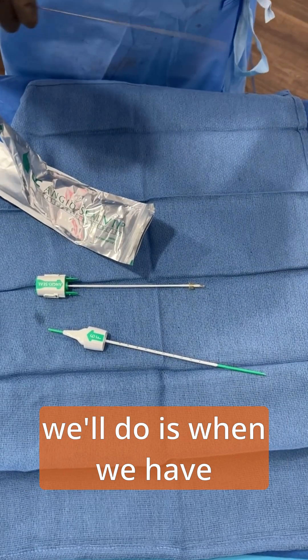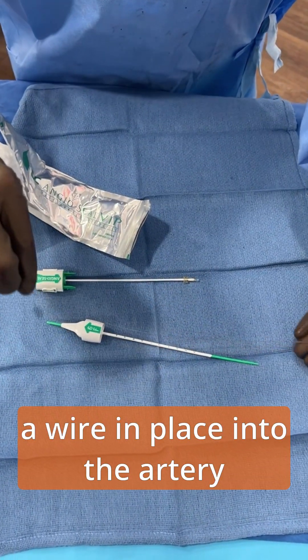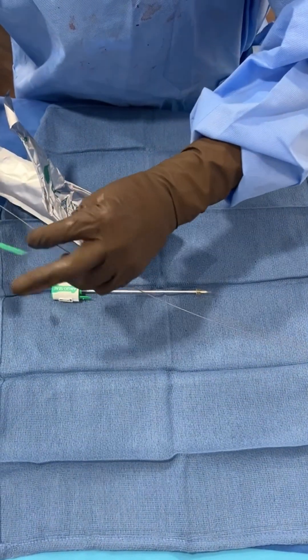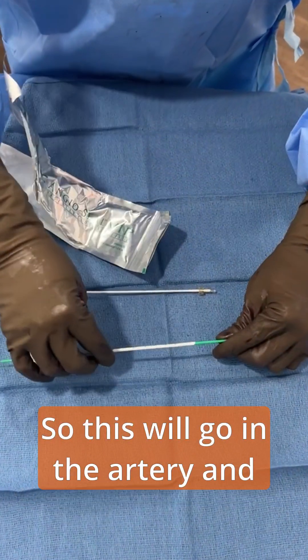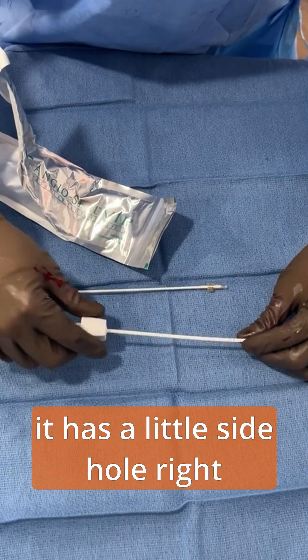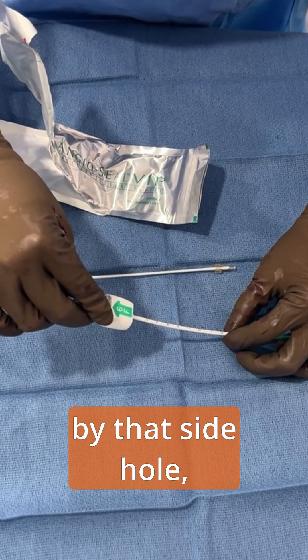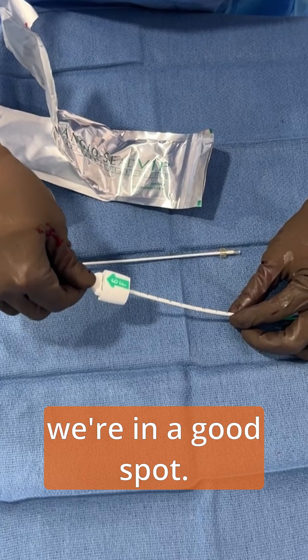When we have a wire in place into the artery that we're going to close, we will take this angioseal and run it over the wire. So this will go in the artery, and it has a little side hole right here. Once you're in the artery and blood is flowing by that side hole, you'll start to see blood come out of the side of this device, and it'll let us know we're in a good spot.